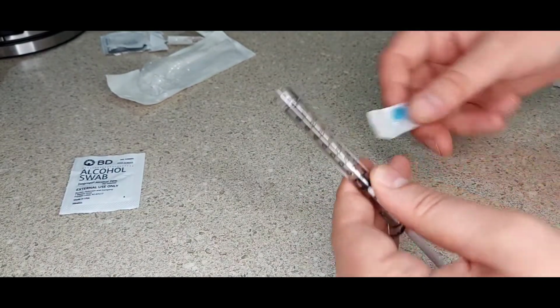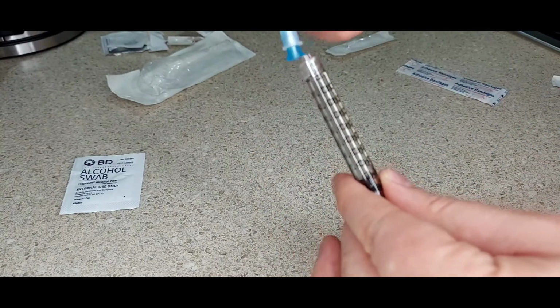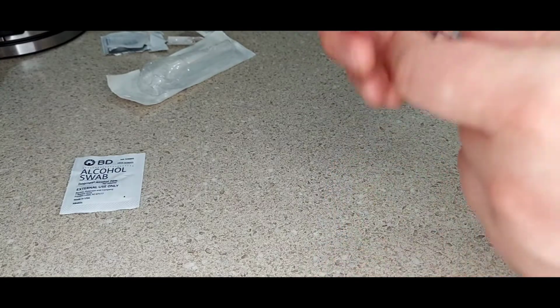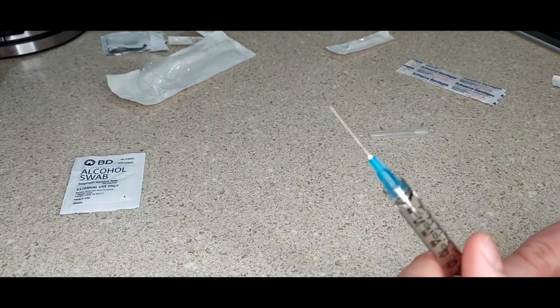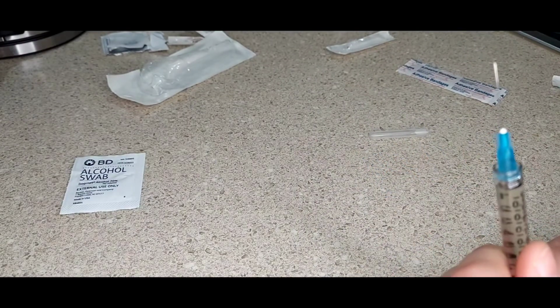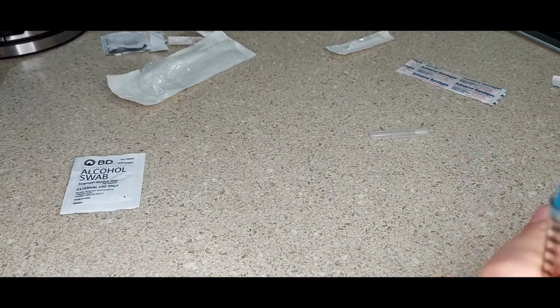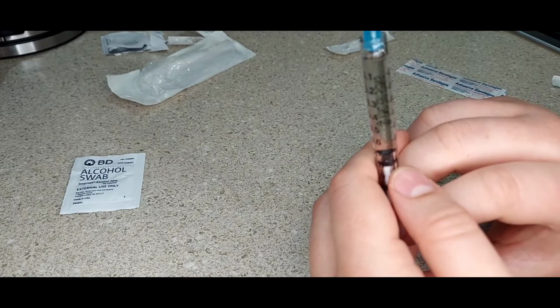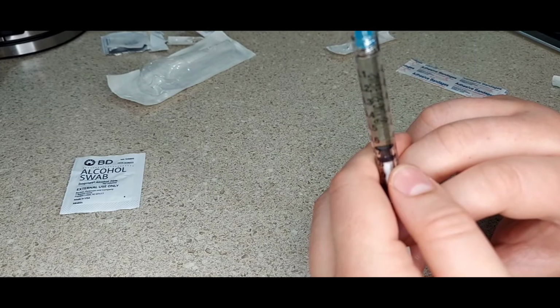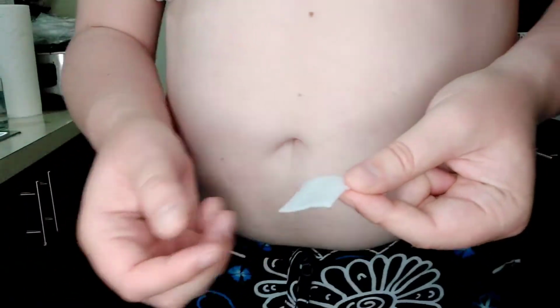So here is where we are going to pop open the needle that we use for the injection. Here I have the 25 gauge. And we are going to do that thing where we get all of the air out of the needle. Is there a little bit? No, it's just the... Is that air? No, that's the ring light. Okay, good. So then, like I said, I overdraw a little bit. So I'm going to go ahead and squeeze this down. Okay, so back into this.